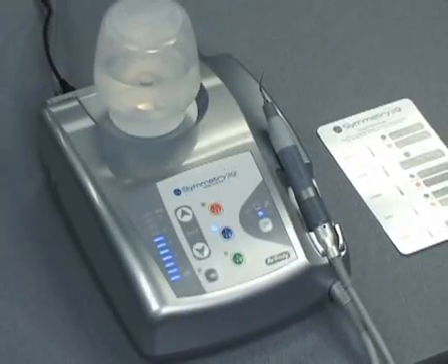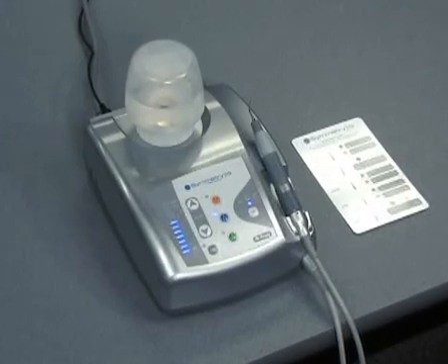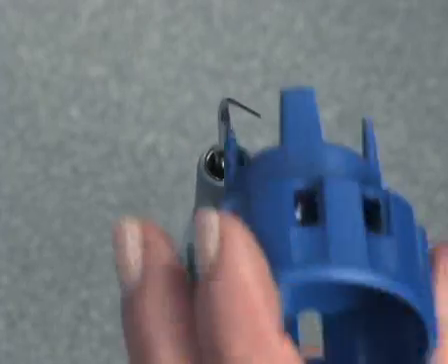Release the foot control and place the handpiece in the handpiece holder. Turn off the power switch located on the side of the unit. When the unit is shut down, the last mode settings in use are automatically retained in memory. Remove the Symmetry tip with a Guardian wrench.